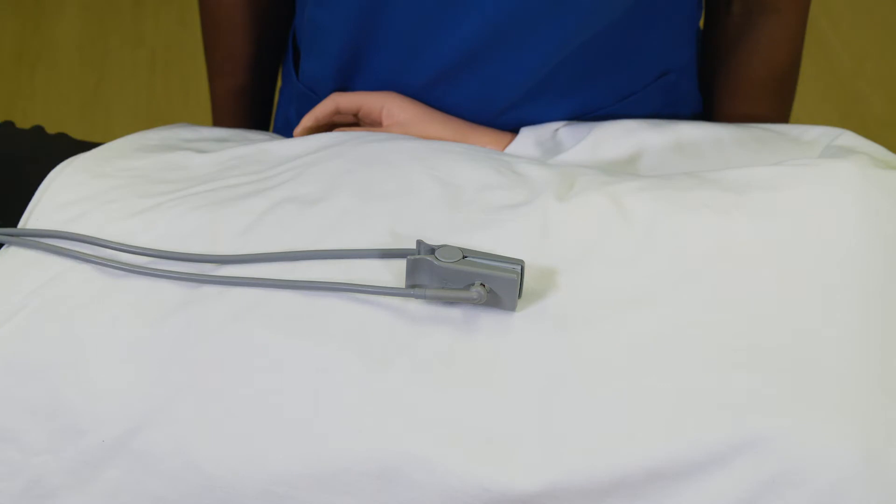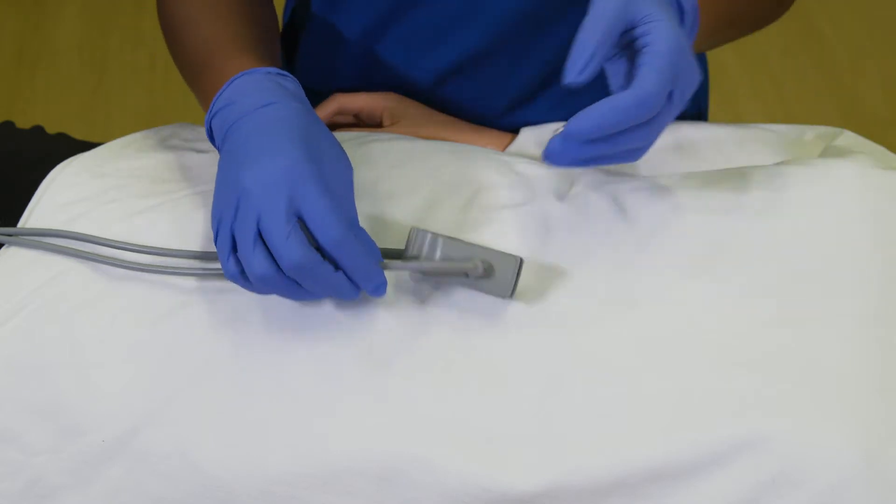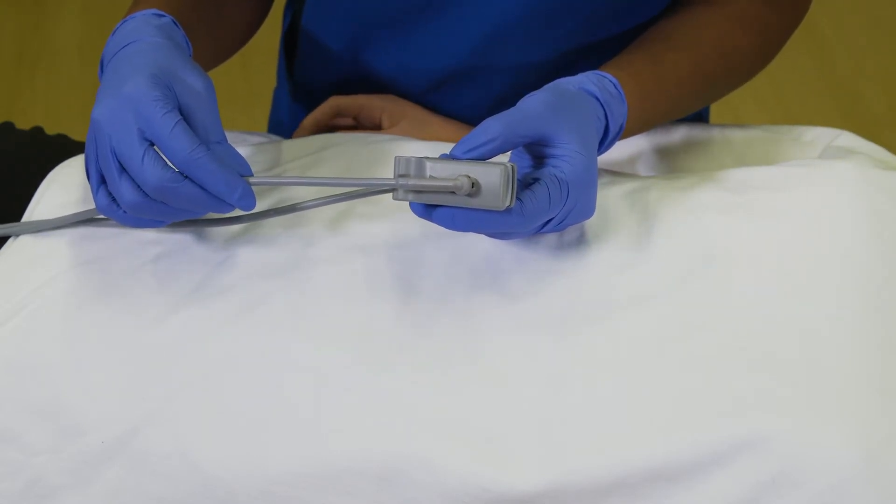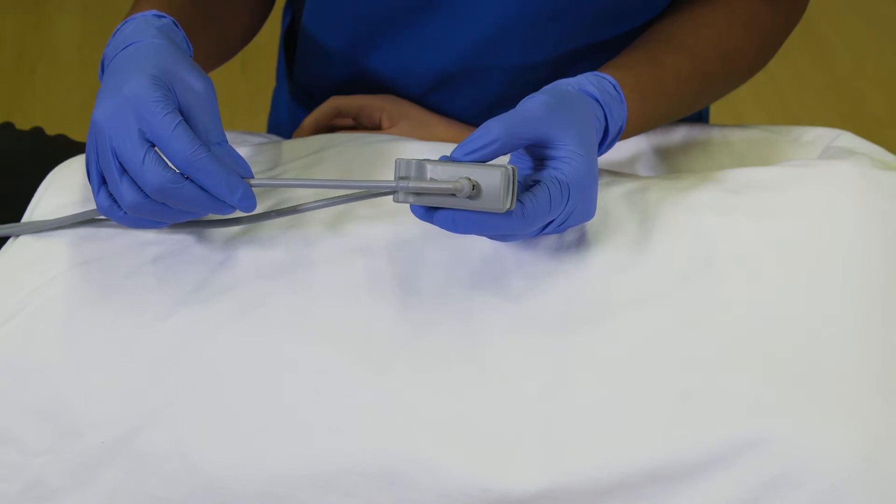After you have selected which attachment is best for your patient, attach it to the SPO2 probe. When changing out the attachments, be careful not to pull from the fiber optic part of the SPO2 probe. It is fragile and will break over time if continuously pulled.